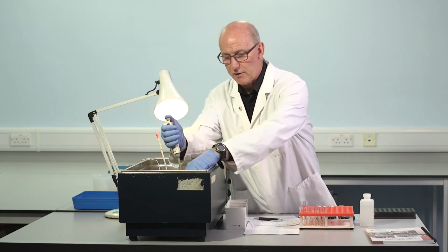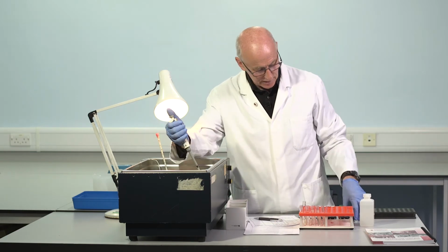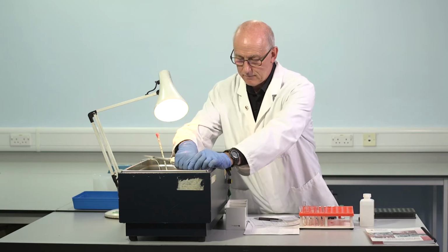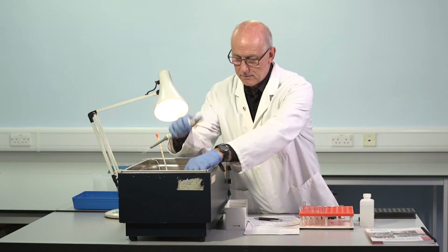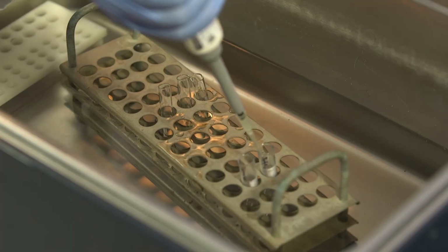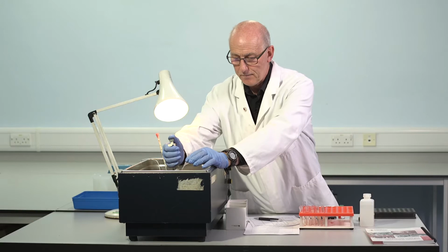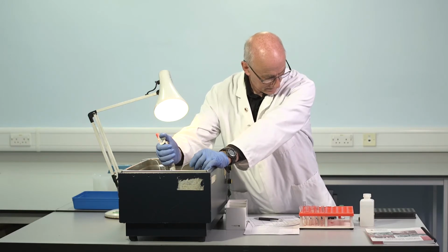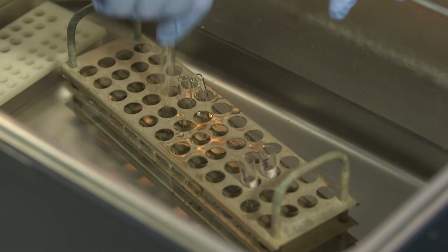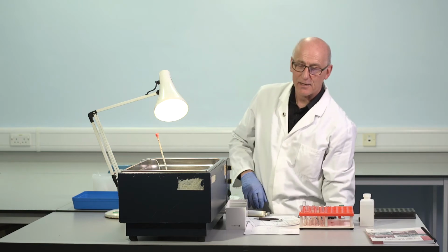I'm going to start the activation whilst we're talking. APTT reagent, first tube, and mix. Second tube at 15 seconds, and mix. Third tube. And mix. So we asked our centres, when you make a factor VIII assay, how many test plasma dilutions?